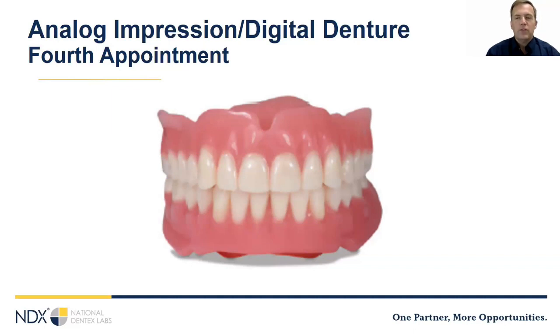Most of the time, these appointments are going to go very quickly. Again, you know it fit because it fits the same as the try-in. The teeth haven't moved unless you ask for them to be moved, because they're in the same position they were in the design. And so you're going to see much more consistency.